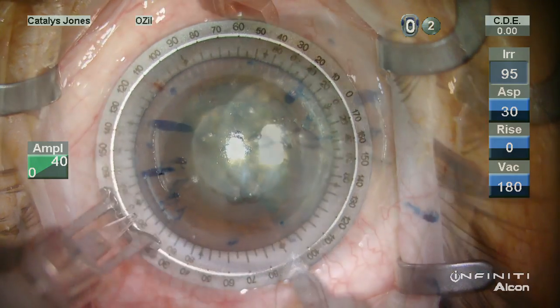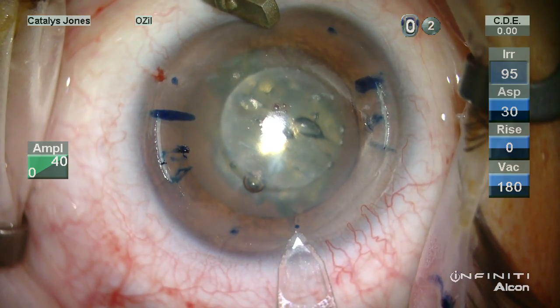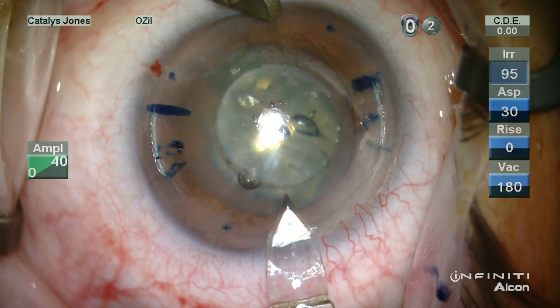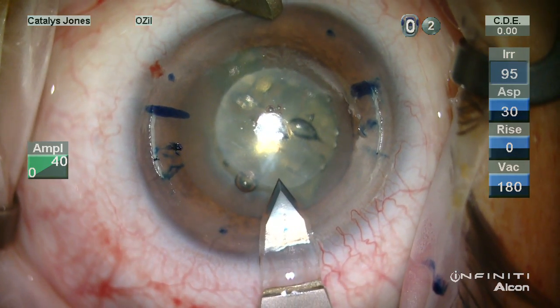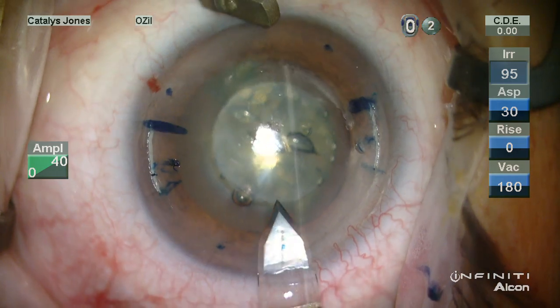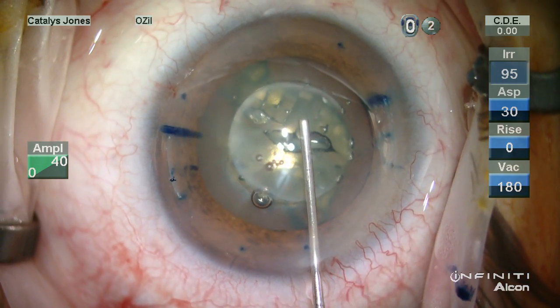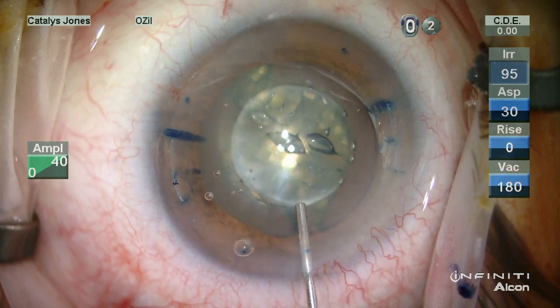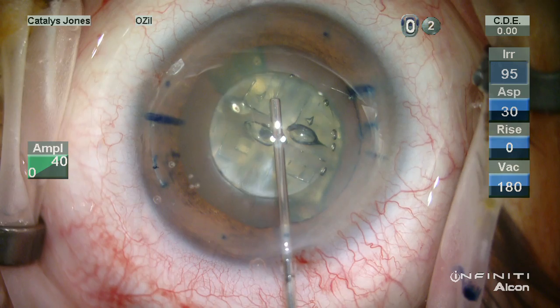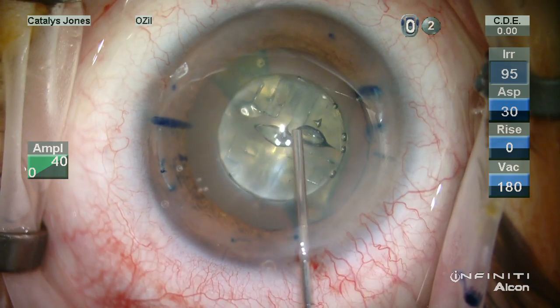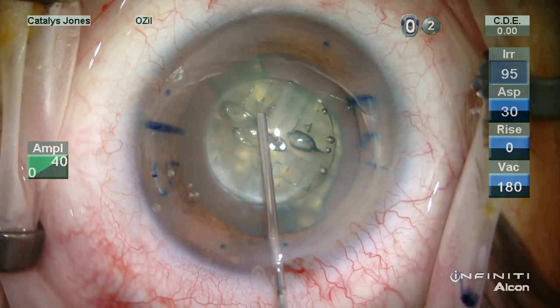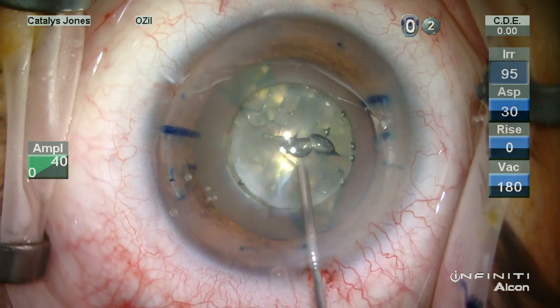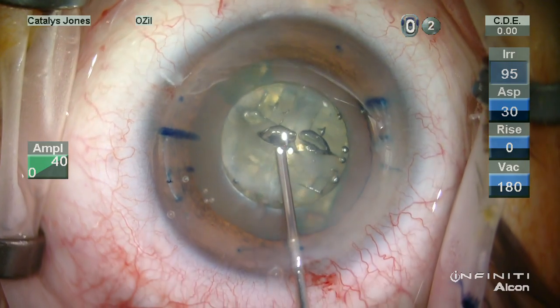This patient does have a mild amount of regular astigmatism, which was addressed with corneal relaxing incisions. During viscoelastic installation, I've confirmed here that the capsulotomy is indeed free-floating and untethered to the peripheral capsule membrane.